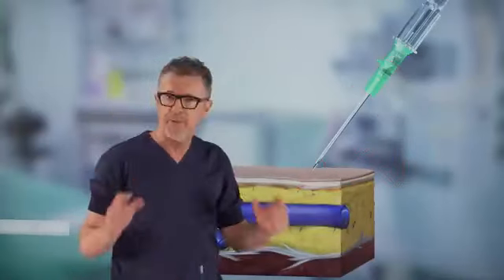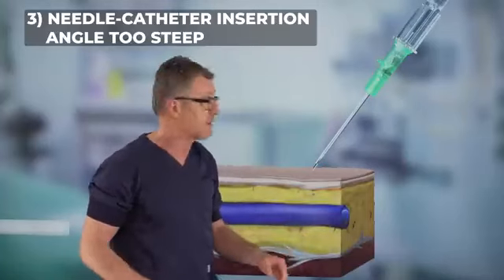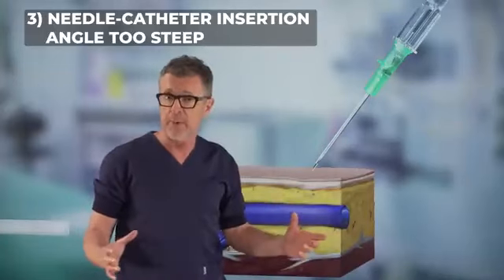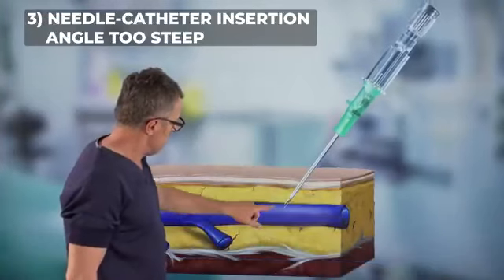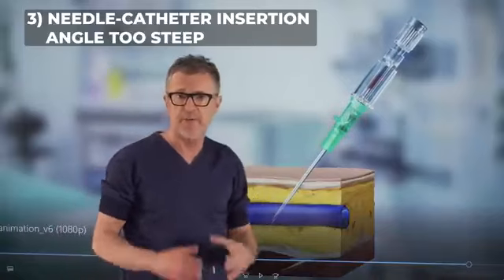Let's see the problem. Failure to advance the needle at a low angle often results in a needle passage through the vein completely, and again, catheter placement paravenously into the subcutaneous tissue. So that's the needle catheter system. It passes through the skin. Now it is in the vein, and as soon as it is in the vein, we can see the flashback.